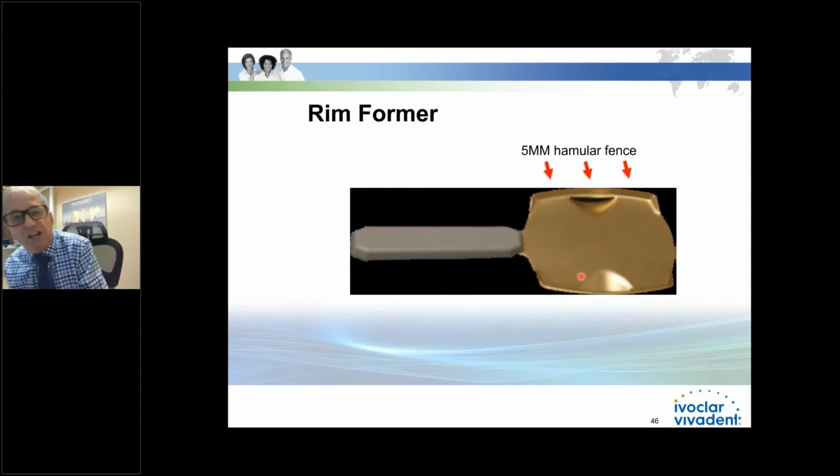Next, we're going to turn around. The laboratory is going to do all of this, of course. All of this takes you, I guarantee you, 5 to 7 minutes, or you can have your assistants do these measurements, and then you come in and check. They could do the denture gauge from the existing denture. They could also try the papillometer and get a measurement from the patient.